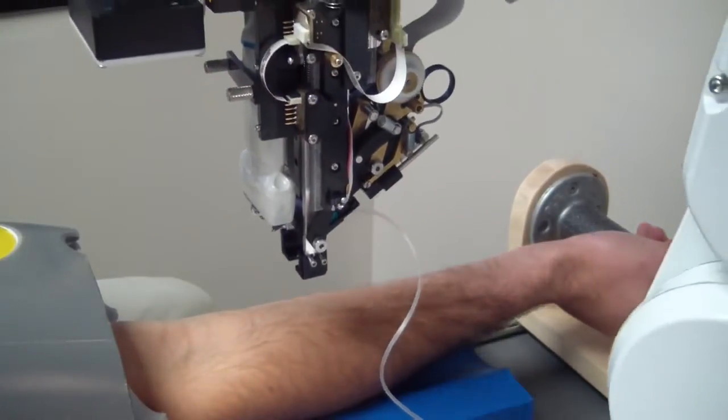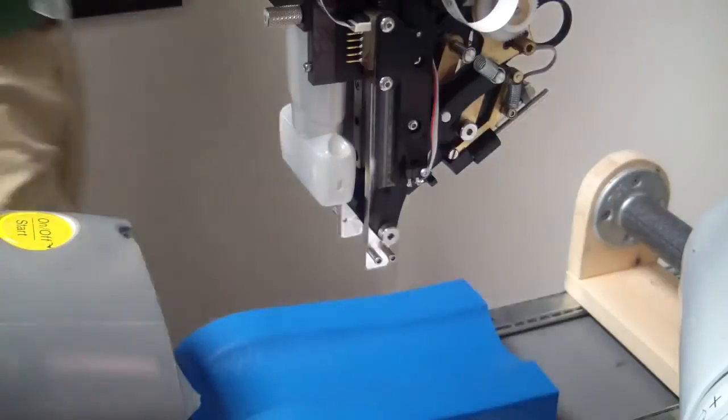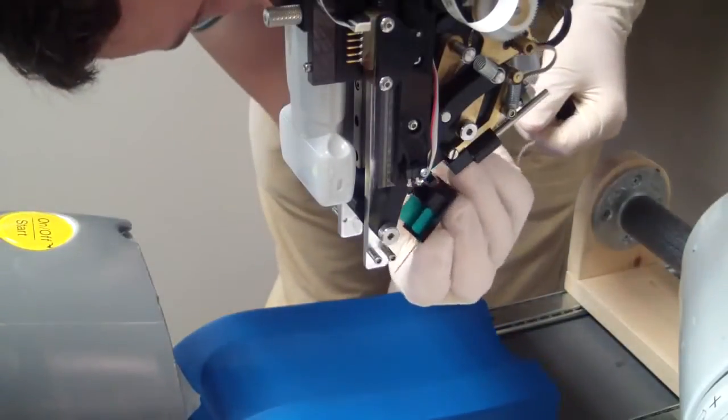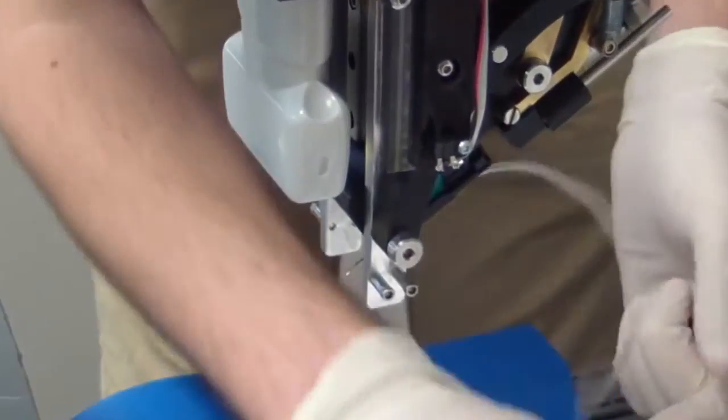Would you be willing to trust your arm to a robot with a sharp needle? A startup company in Miami, Florida is betting that you would. This is a prototype of the V-Bot, the first robot phlebotomist.